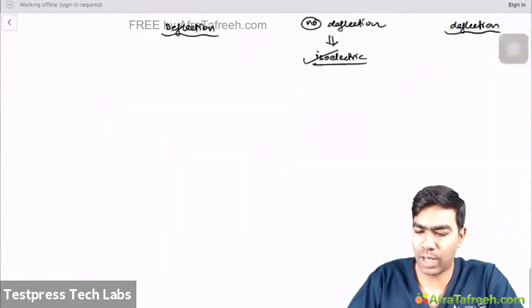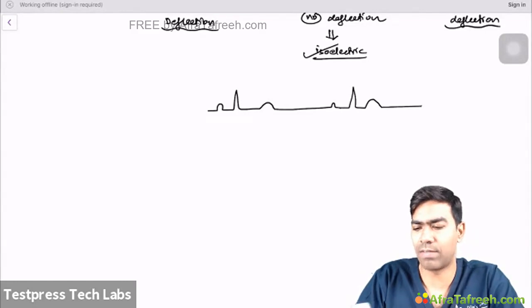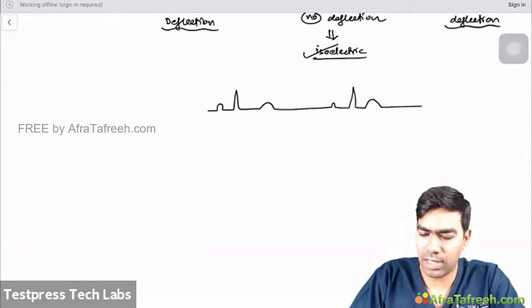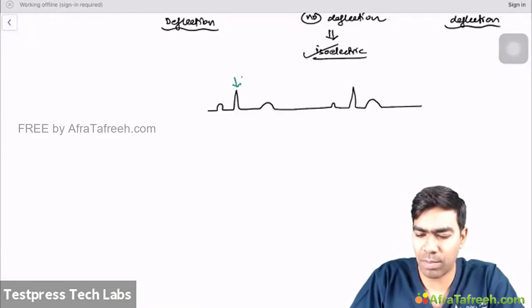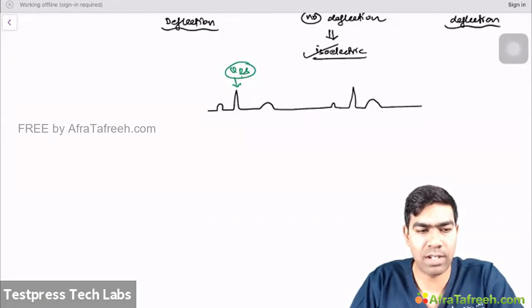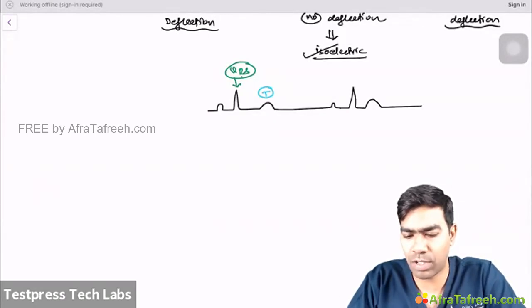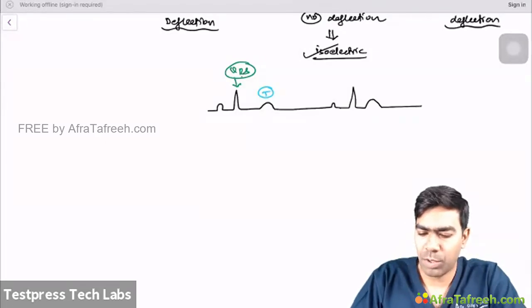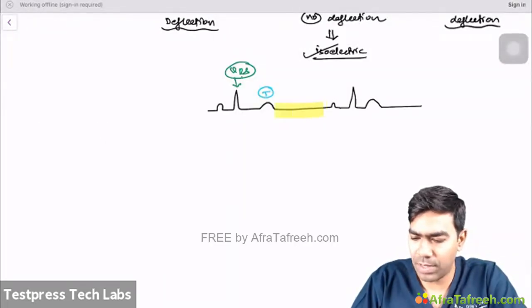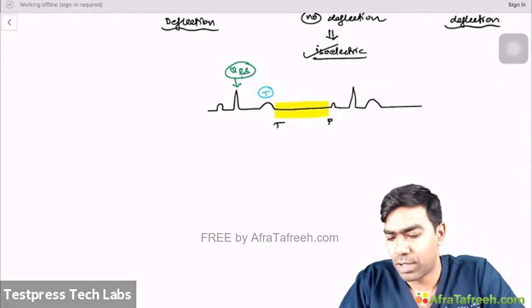So if you really want to extrapolate this into the ECG, you have a P wave, QRS complex, T wave, then you have another P wave, QRS complex, and a T wave, like this and so on. This is the time of ventricular depolarization, which means this is the QRS, which denotes the time where the waves are propagating. This is the time of ventricular repolarization, because this is where the ventricular repolarization is producing the T wave. If we take the isoelectric segments, for example, this TP segment is a big isoelectric segment. That's very important for our understanding.